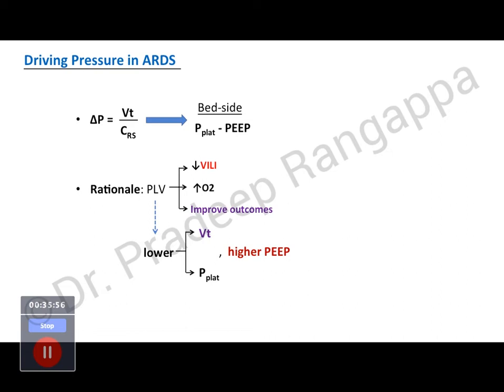If you remember at the end of my lecture these three things, I think it's good enough, because as I said, this science is complex for non-core ICU members. But if you just remember these three, low tidal volume, high PEEP and P-plat and driving pressure, I think I've done my justice in making at least remember this. Please use low tidal volume and optimize the PEEP. That's all you have to remember.